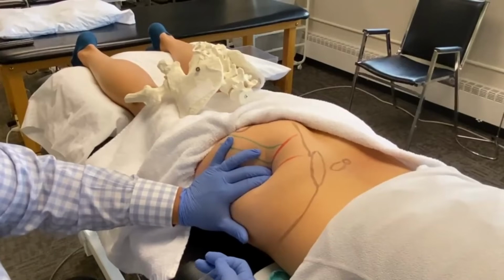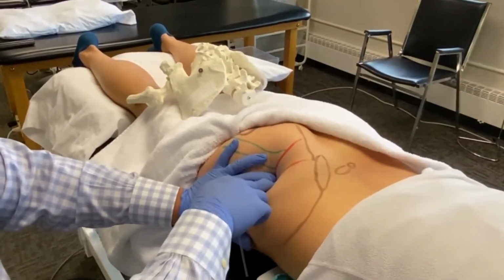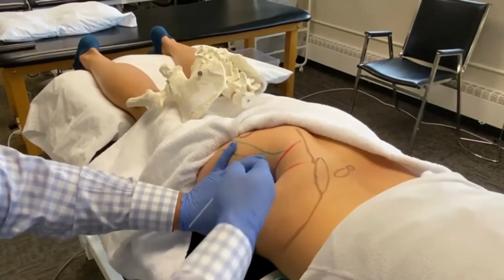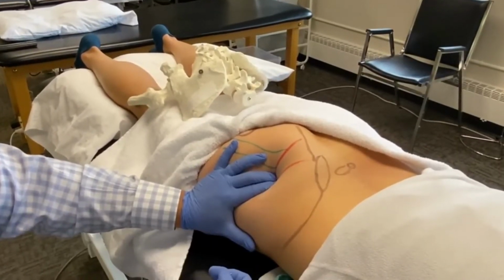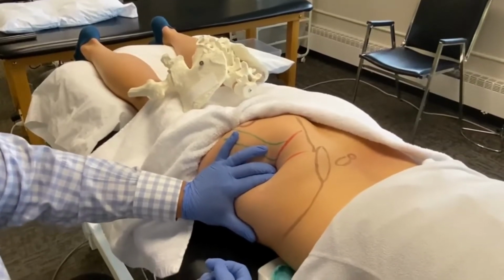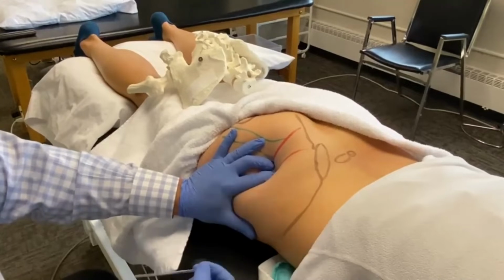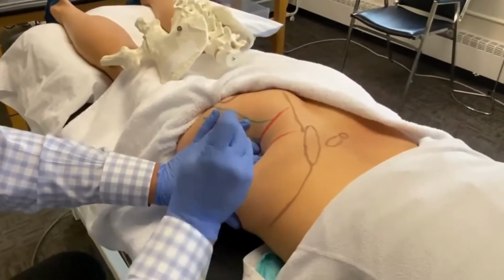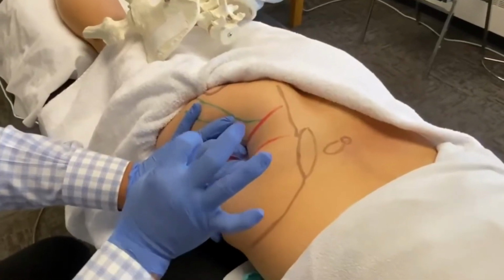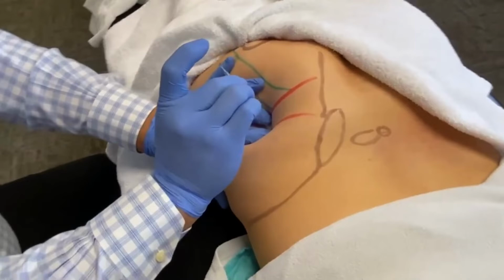Furthermore, compress and palpate into the tissue until you feel the bony backdrop of the posterior acetabulum and posterior femur. Compress, spread the tissue to create a window of treatment. Place the needle between your fingers in an oblique direction. Quickly tap.